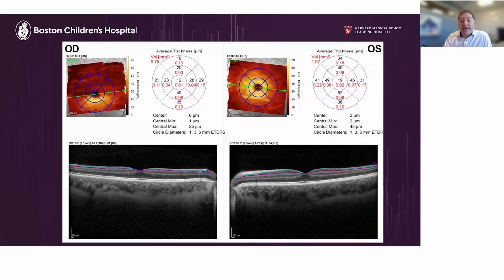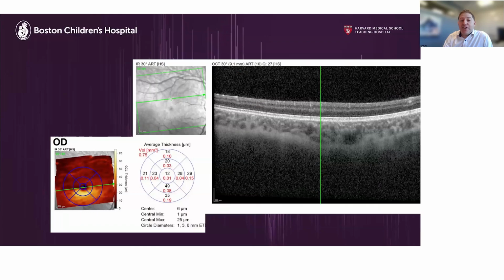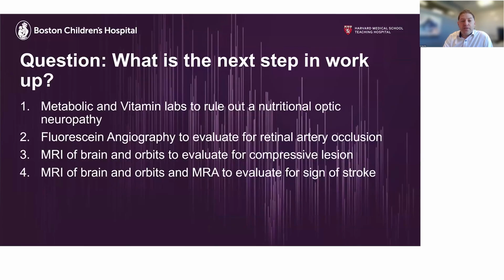She's lost her right inferior visual field, and now she has thinning of that macula. So that's how it looks, just like a visual field. The fact that she has RNFL thinning and GCL thinning makes me realize that this has been going on for a really long time. And just to cut through, you can see there's no evidence of other interretinal issues.